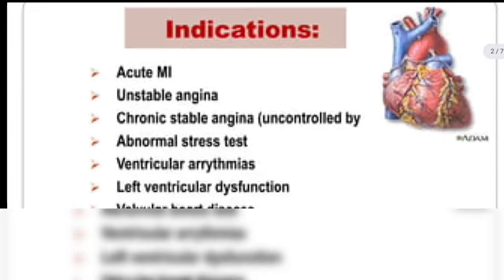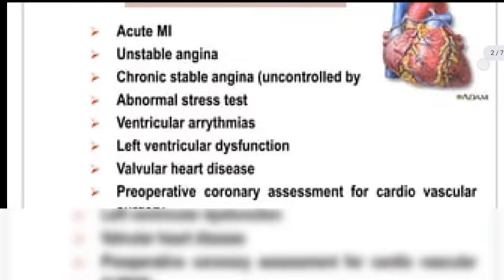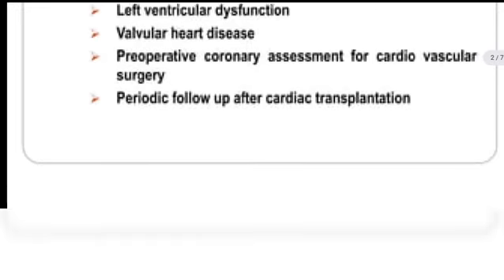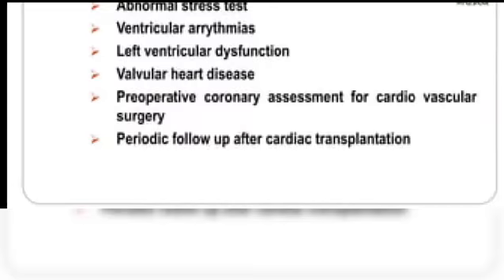There are some indications for coronary angiography: acute MI, unstable angina, chronic stable angina that is uncontrolled or has an abnormal stress test, ventricular arrhythmias, left ventricular dysfunction, valvular heart disease, preoperative coronary assessment for cardiovascular surgery, periodic follow-up after cardiac transplantation, chest pain, narrowed arteries, breathing difficulties, so angioplasty or bypass surgery, etc.